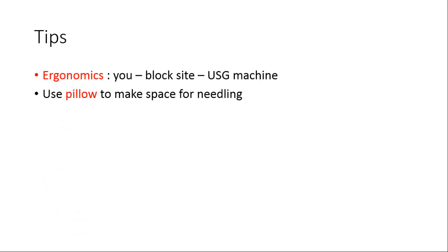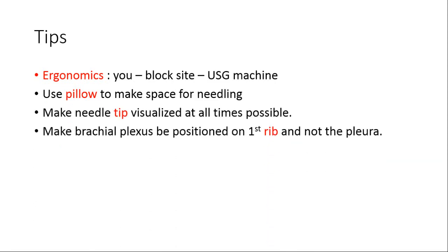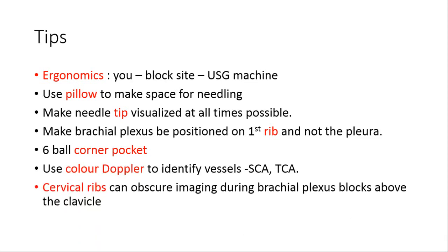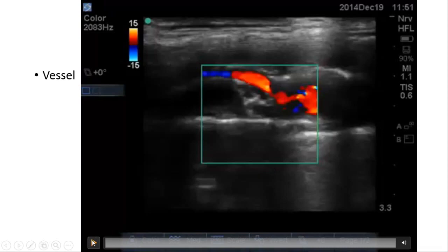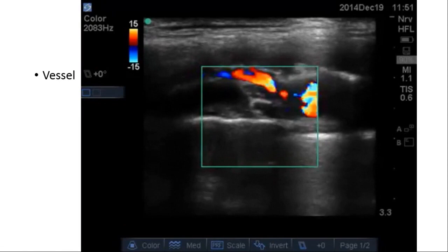For safety and ergonomics, use a pillow to make space for needling. Always keep the needle tip visualized. Make sure the plexus is on the first rib, not on the pleura, to avoid pneumothorax. Seek the corner pocket and use color Doppler to identify vessels, because cervical branches and vessels in the supraclavicular region — such as the dorsal scapular artery and branches of the subclavian vessels — may obscure your scanning of the brachial plexus.